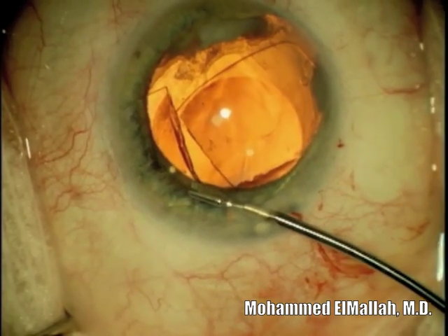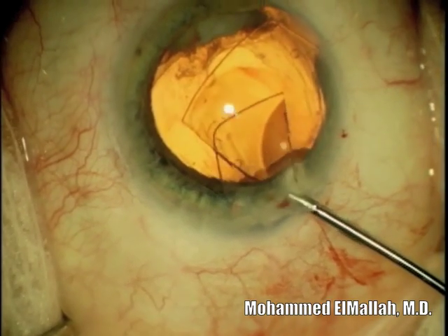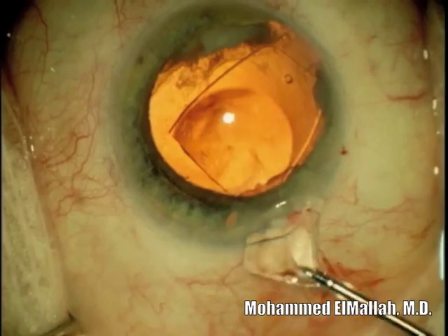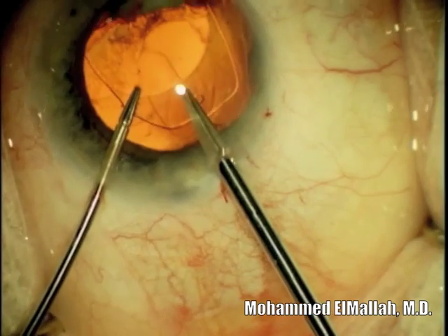The first segment is removed through the main incision. The remaining lens fragment is then cut in half.